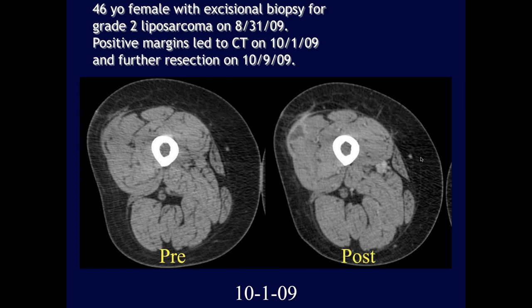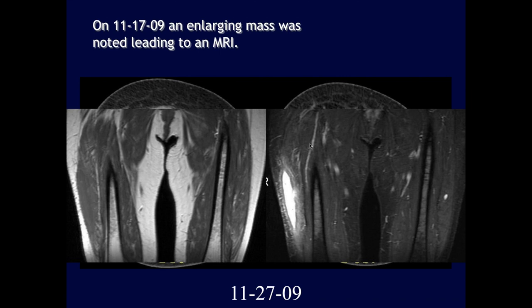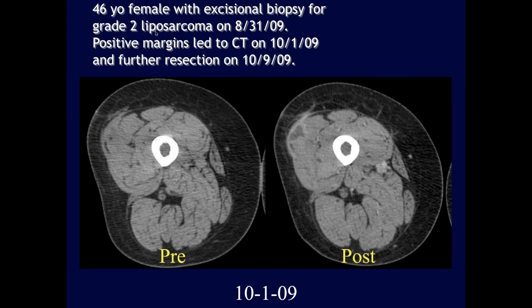A 46-year-old female with excisional biopsy for grade 2 liposarcoma with positive margins, followed by CT and further resection. On the October CT, there's an enhancing intramuscular collection that could be an abscess or seroma. Remember, higher-grade liposarcomas won't necessarily have detectable fat on imaging, even though fat is visible under the microscope.